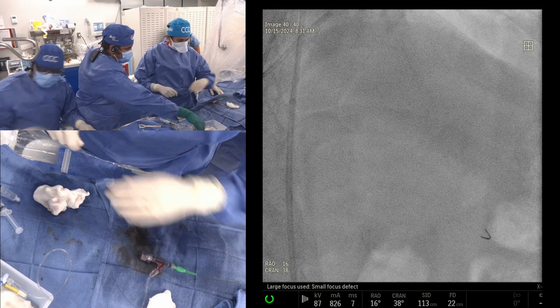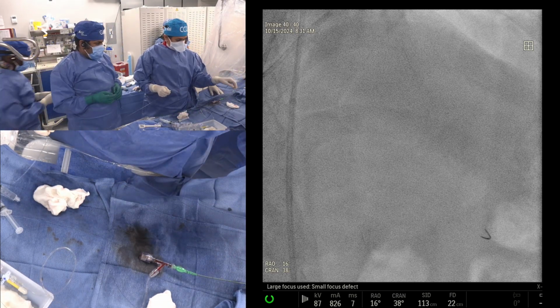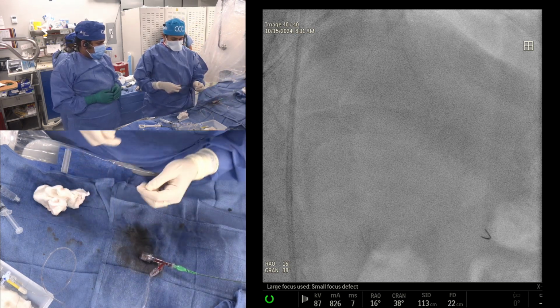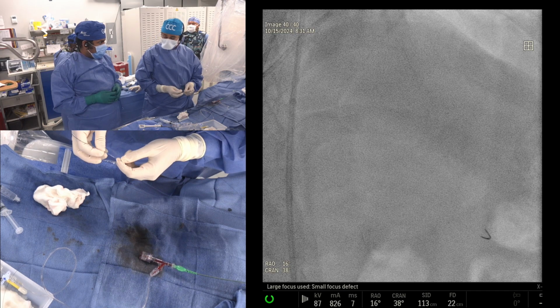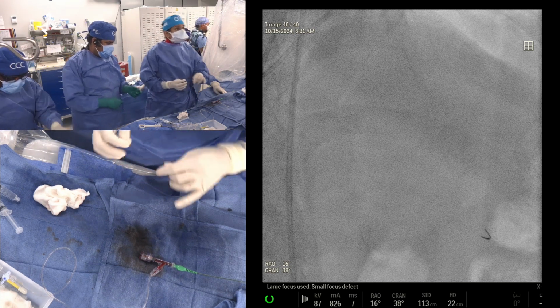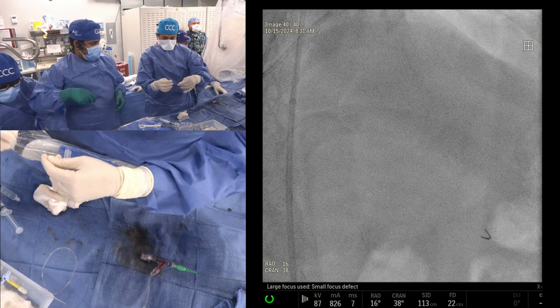So we are dilating with a 2.5 by 30, and we'll ask people if they do want to do IVUS or anything. We have the IVUS ready in case we need it. I think it will be a good one to see that truly there is no calcium. I'd be even interested to know the true size of the vessel. It may be completely underfilled and maybe larger than it appears angiographically.